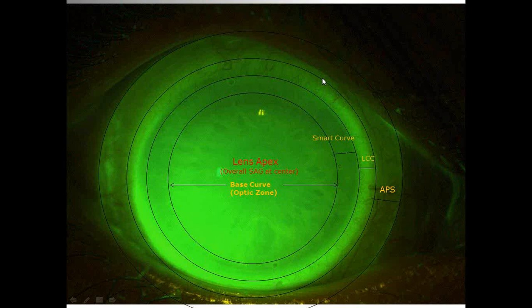Very good, thank you. Yeah, because it is difficult to get that lens to center always, no matter what you do in terms of the landing zone or the sagittal depth. So one thing I would just add too, going back to that slide, is that if a doctor is evaluating a fit and they're not using a Wratten filter, they may not be seeing that they actually have more fluorescein there than they think they do. It's absolutely crucial, in my opinion, when we are looking for limbal clearance that we use a Wratten filter to help determine whether we have fluorescein, because without a Wratten filter you just don't have enough sensitivity to see that maybe 20 or 30 microns of clearance you might have. It just gets lost without having the Wratten filter to amplify the fluorescein.